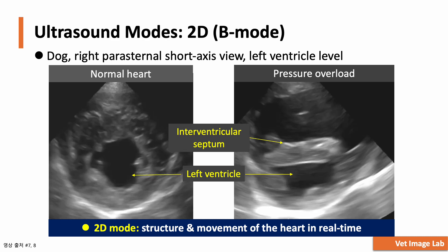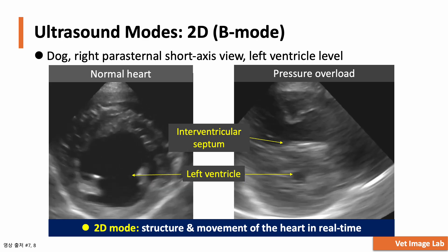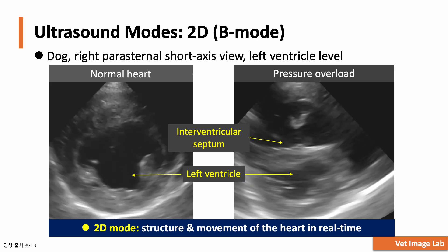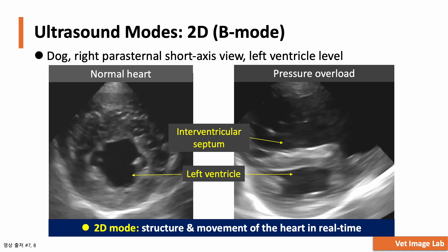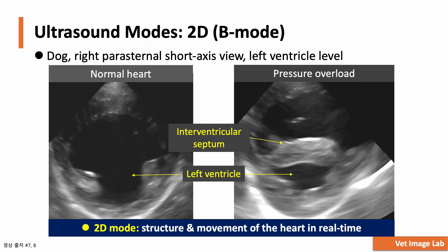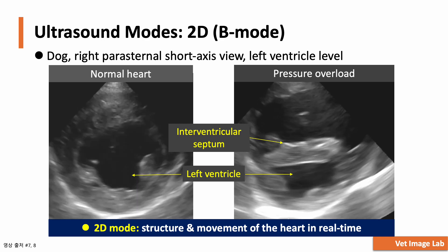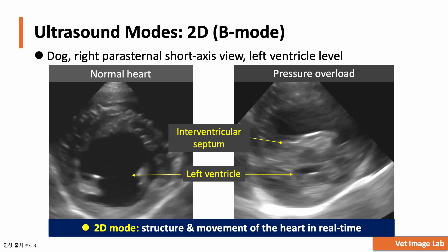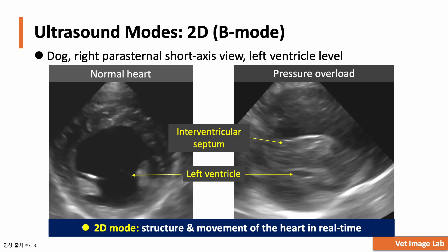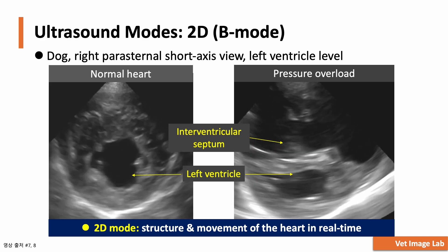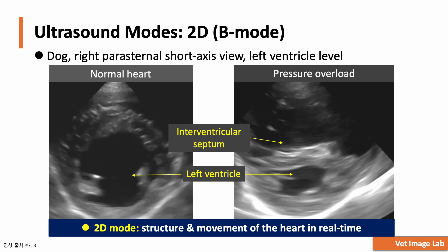Let's look at another important B-mode application: assessing ventricular shape and pressure overload. Here we have two echocardiographic images obtained from a right parasternal short-axis view. On the left, we see a normal heart where the left ventricle maintains its typical round shape. On the right, this dog has right ventricular pressure overload — notice how the interventricular septum is flattened instead of curving naturally. This D-shaped left ventricle is a hallmark of conditions like pulmonary hypertension or right-sided heart disease. B-mode is essential because it allows us to evaluate both structural shape changes and dynamic motion changes simultaneously.